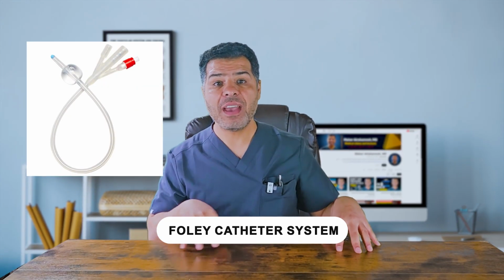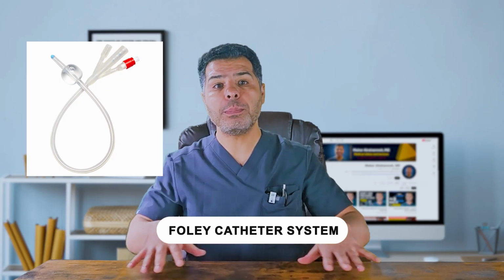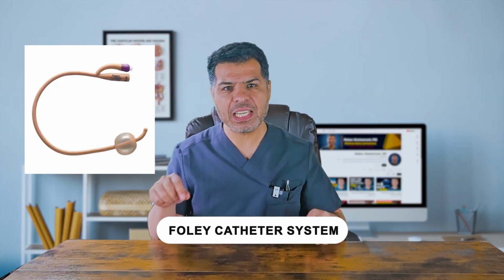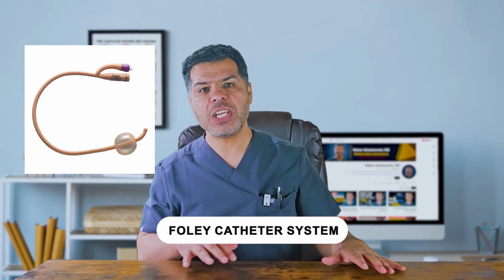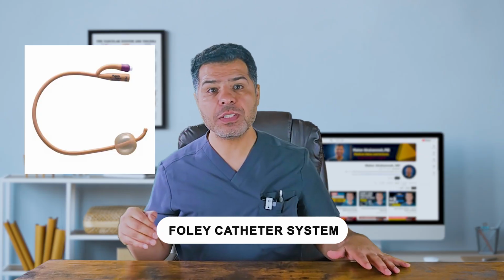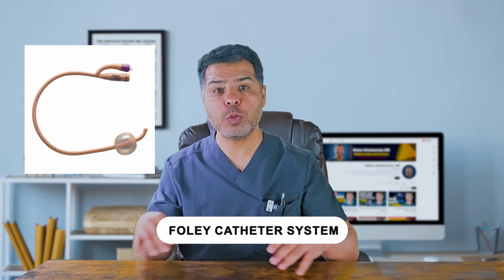3-way catheters have an additional port for continuous bladder irrigation, commonly used post-TURP or in patients with significant hematuria and clots. A coudé Foley catheter is a type of Foley catheter with a slightly curved or bent tip designed to maneuver around blockages such as in enlarged prostate or to navigate a narrowed urethra. Unlike a standard straight-tipped catheter, the bent tip helps pass through the urethra and into the bladder, making it useful when standard catheters fail to be inserted successfully.